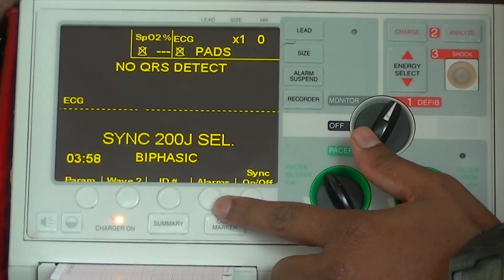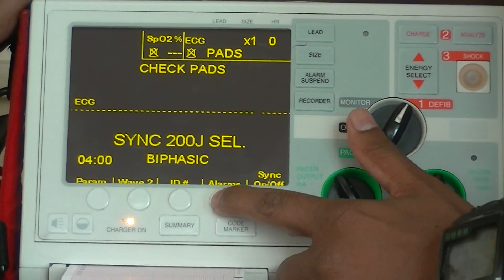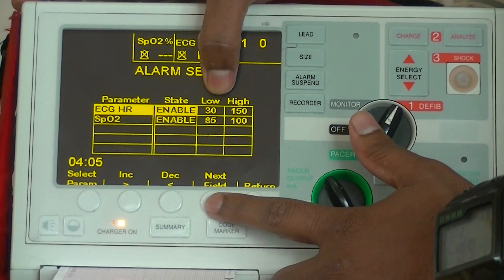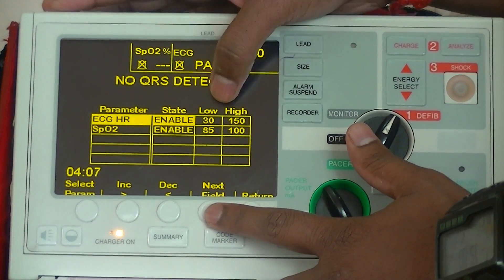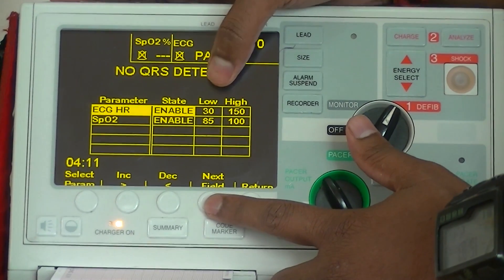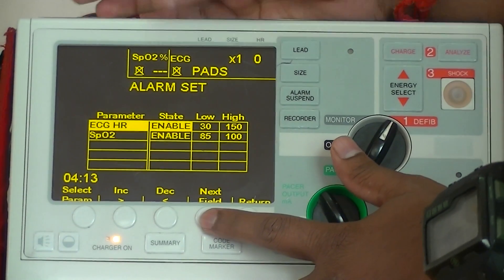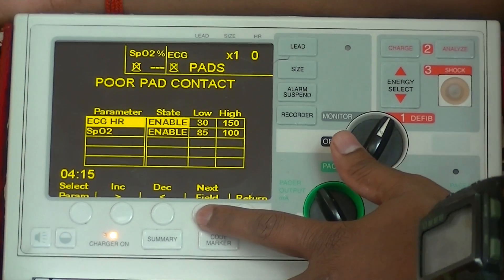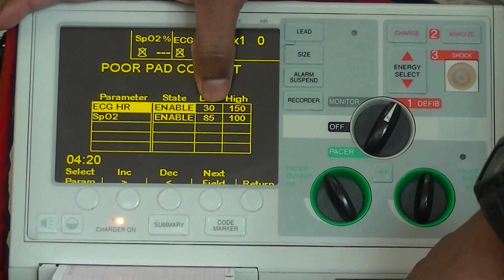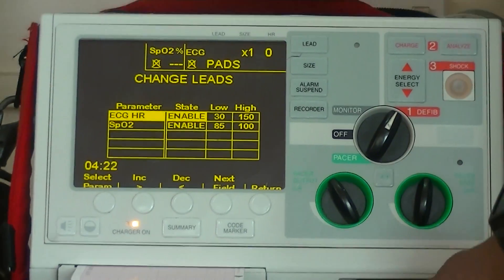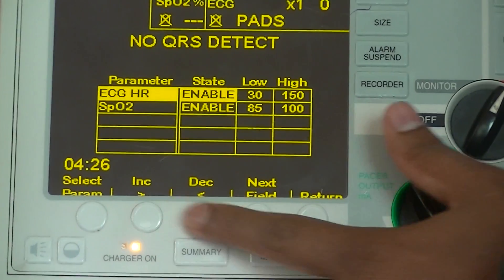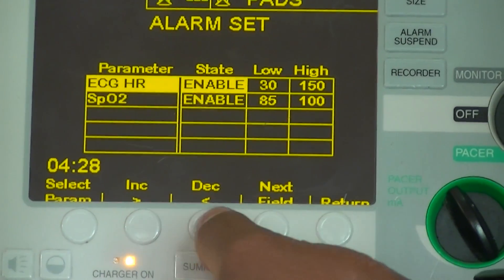Next to this, you can see the soft keys, including alarm, where you can set the alarm limitations. For ECG monitoring, I have set the low limit at 30 beats per minute and the high limit at 150. When the heart rate goes beyond or falls below these limits, it starts giving you an alarm. Similarly for SpO2 saturation, the minimum is 85% and maximum is 100%. You can increase or decrease these options by using the soft keys displayed on screen.